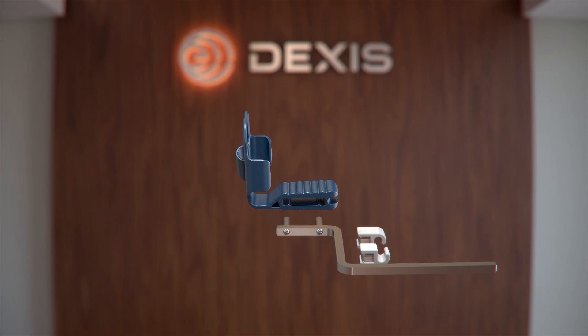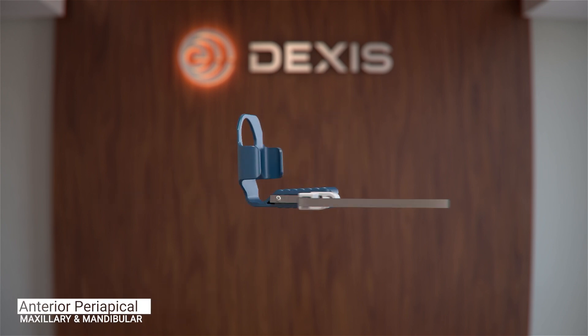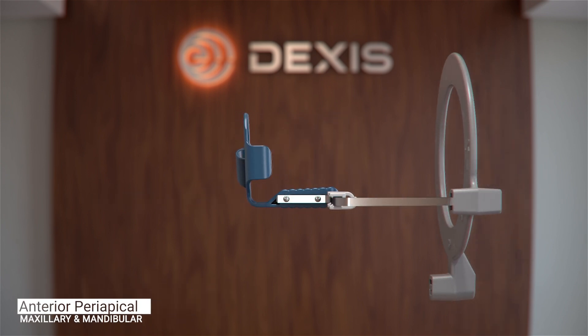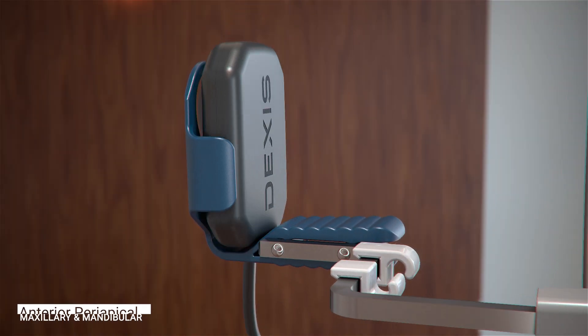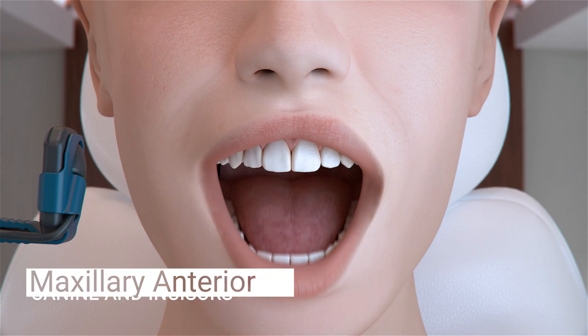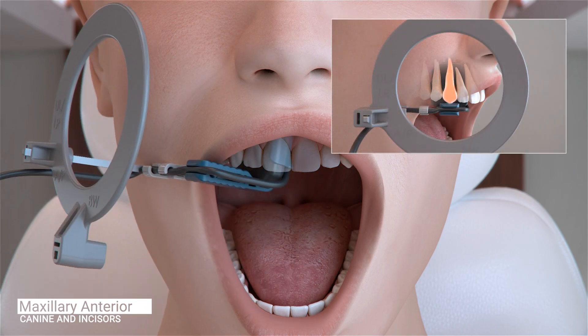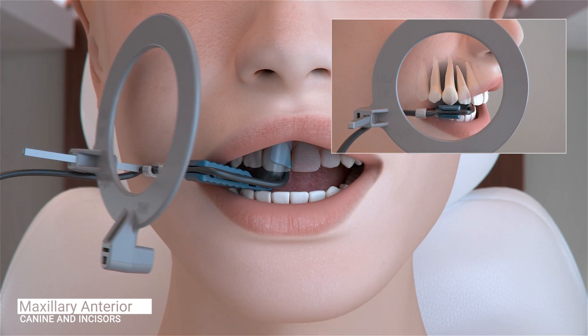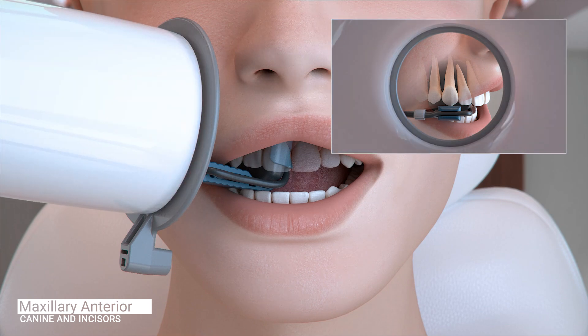We will now move on to capture anterior periapical images. For anterior periapical images, you will use the same aiming bar and ring configuration. However, you will switch the yellow posterior bite block to the blue anterior bite block. Begin by taking the maxillary right canine. Position the sensor so the canine is centered on the sensor, well into the palate and parallel to the long axis of the tooth. Ask the patient to close and slide the aiming ring as close to the patient's face as possible. The cone of the X-ray emitter must be placed flush with the aiming ring and then trigger the exposure.